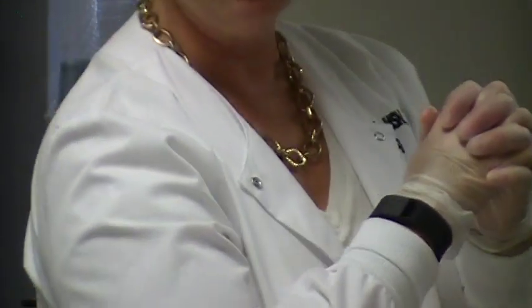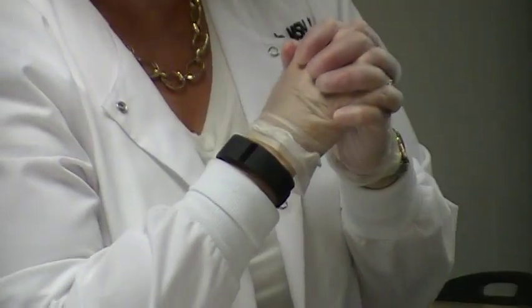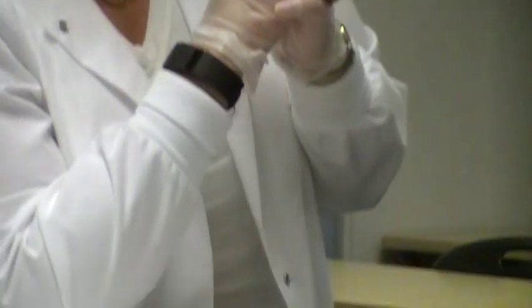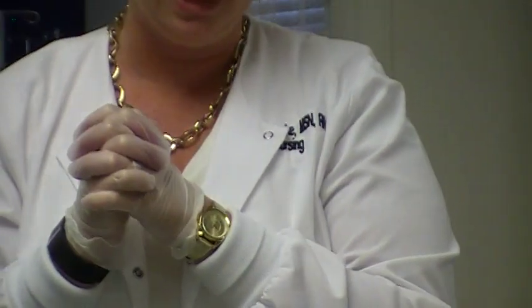So, we're going to get rid of our package, and you can just lightly use your elbow to slide it off the table. If you've got your garbage can right there, then you could go ahead and get that done. The next thing that we're going to do is set up our sterile field. So, I have my box of sterile equipment over there to the side.